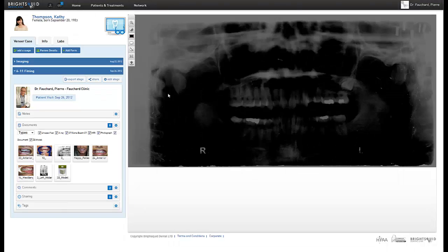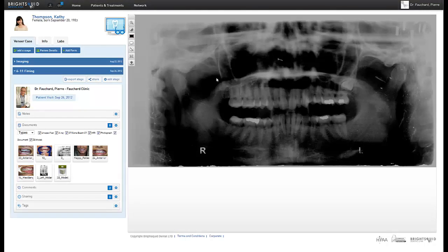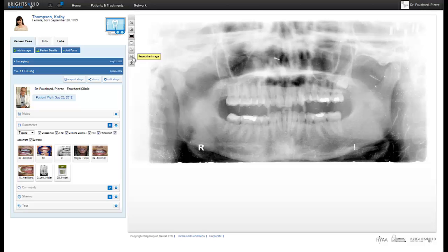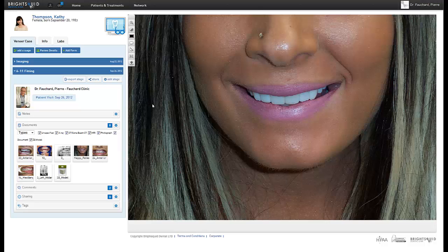Single-click on this button, then click and drag inside the image viewer to adjust the brightness and the contrast of the image. To reset the image to its default light levels, click this Reset button here.